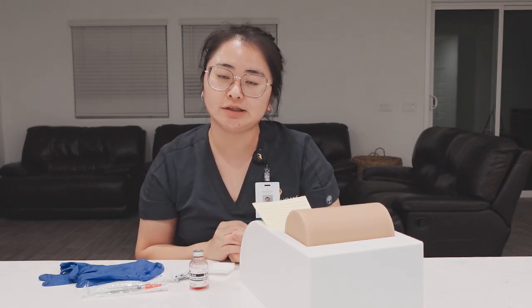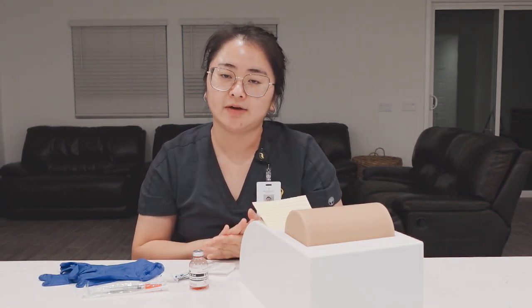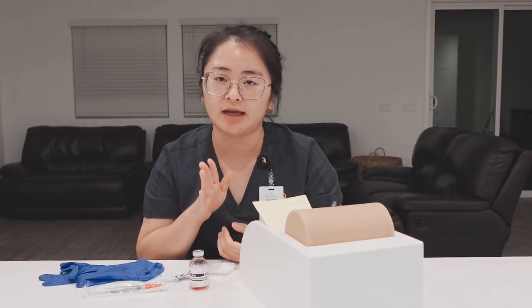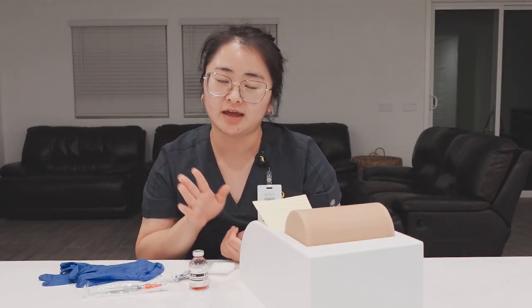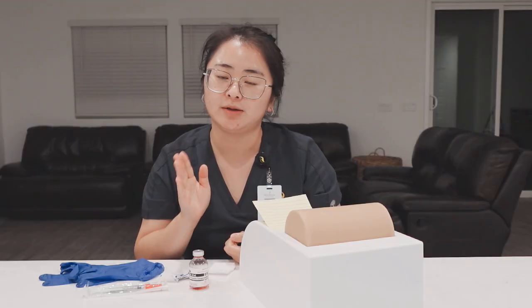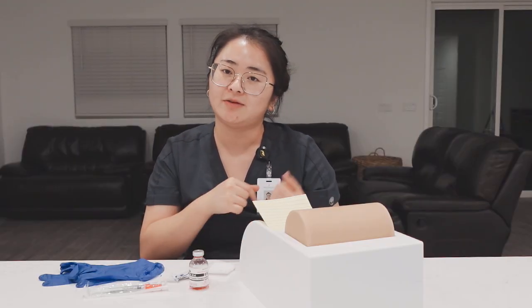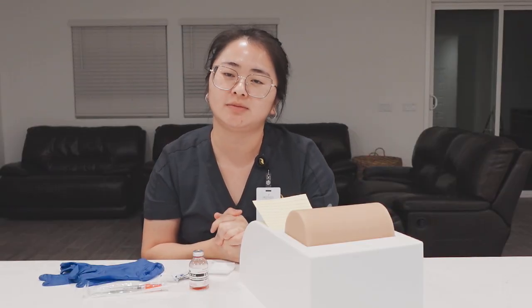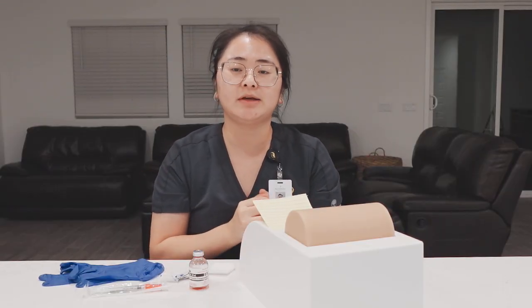Okay. So for the injection today, we need a 25 to 27 gauge, and it needs to be 3/8 to 5/8 of an inch for the needle. For the syringe, it needs to be 1 to 3 milliliters. Also, if you see my video become blurry for a split second here and there, it's just my camera trying to focus on me. Okay, now we can begin.